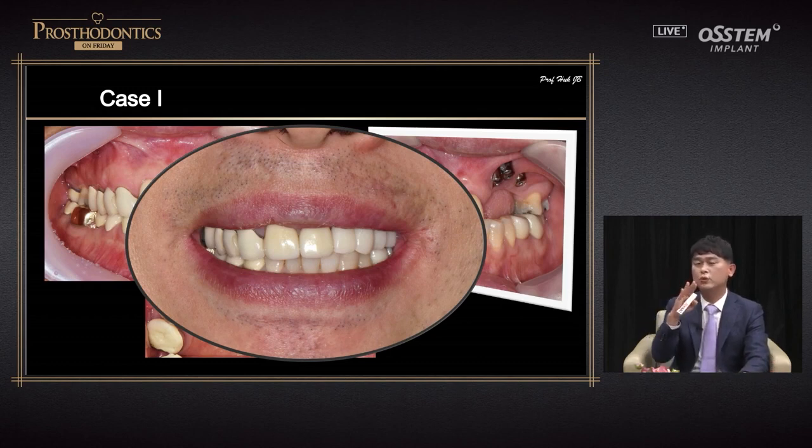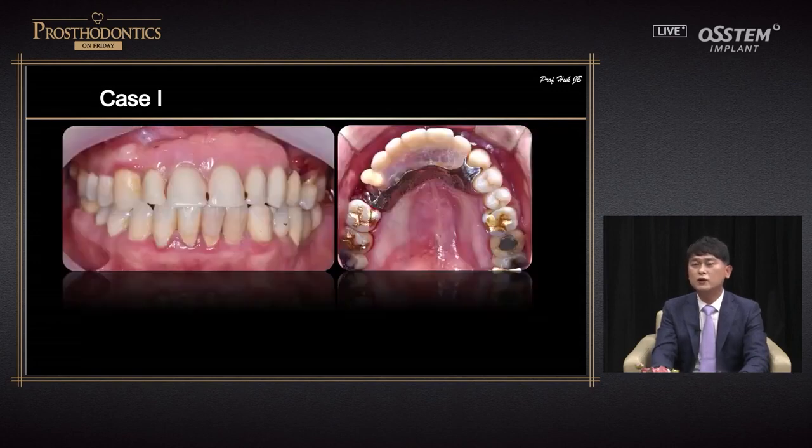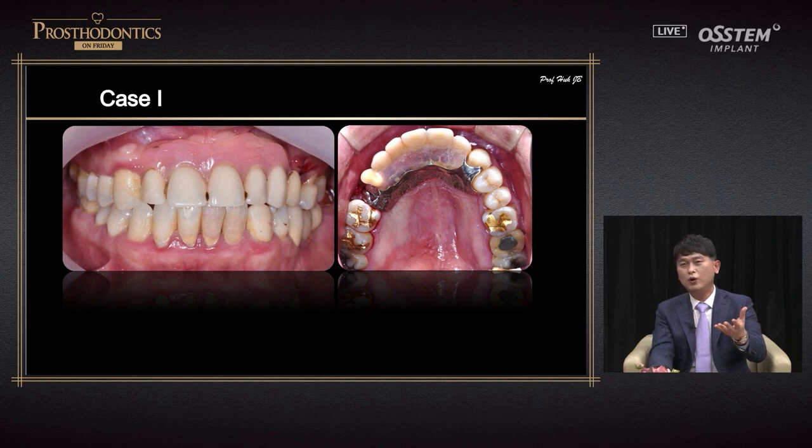He used to have a sunken left upper lip. Now I created the lip support. A similar patient. There are so many cases that are good for partial cases.